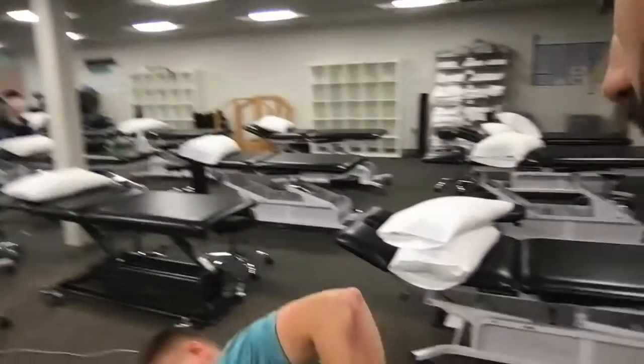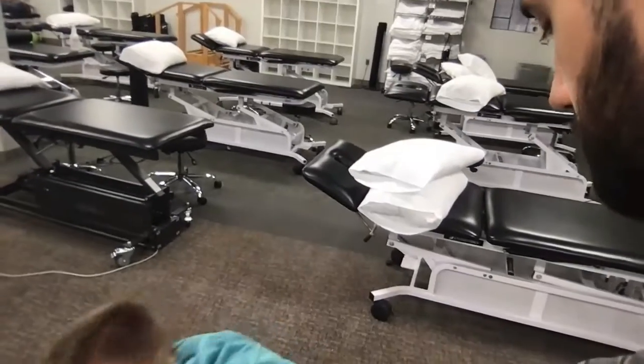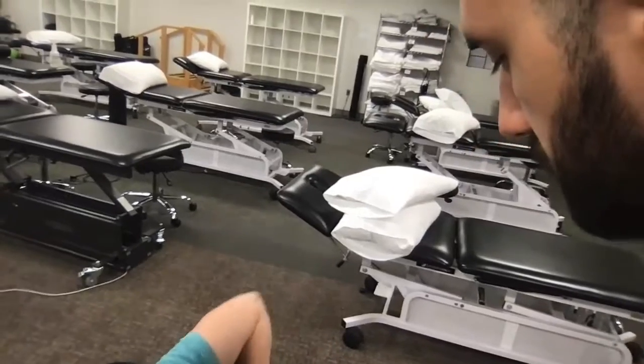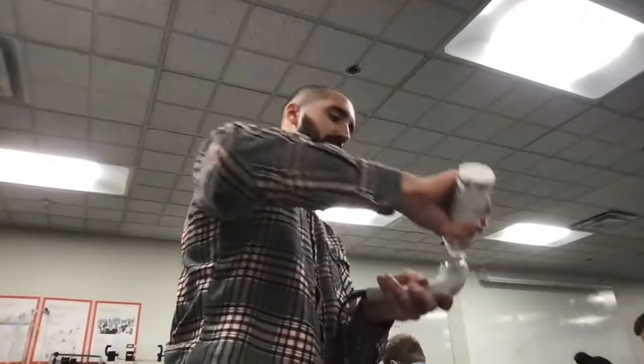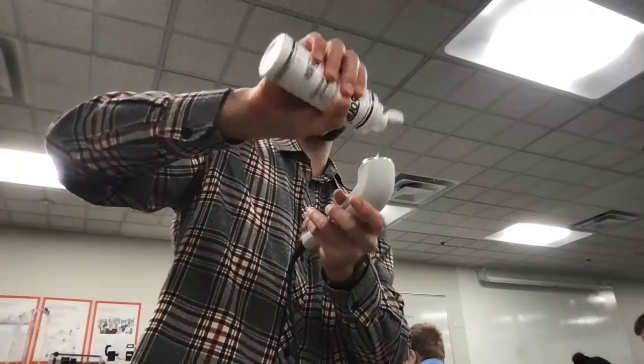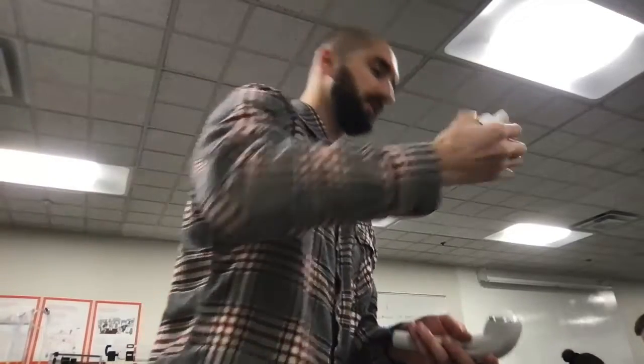So Bonnie, I'm going to go ahead and lift up your shirt just a little bit to expose your L5. I'll fold this down a little. Before starting the machine, we want to make sure that we have some conductive ultrasound lotion on here in order to protect the crystal.